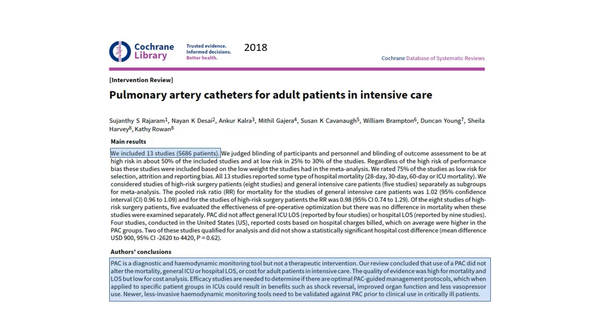They highlight one of the things we already mentioned, which is that PAC is a diagnostic and hemodynamic monitoring tool, but not a therapeutic intervention. Our review concluded that the use of PA cath did not alter the mortality, general ICU or hospital length of stay, or cost for adult patients in the intensive care unit. The quality of evidence was high for mortality and length of stay, but low for cost analysis.